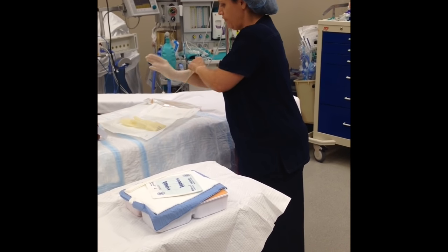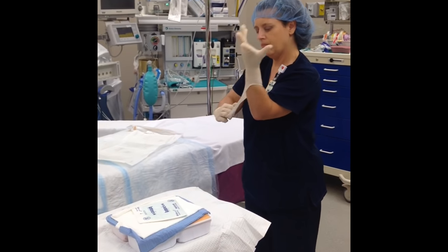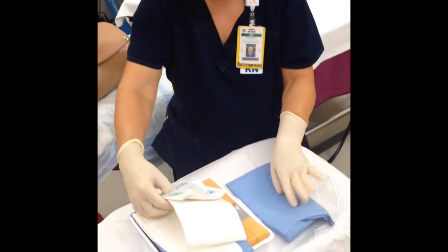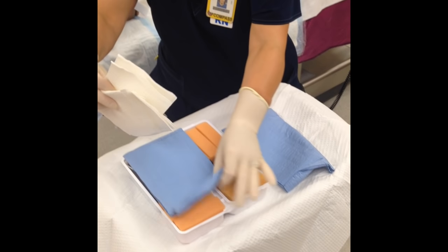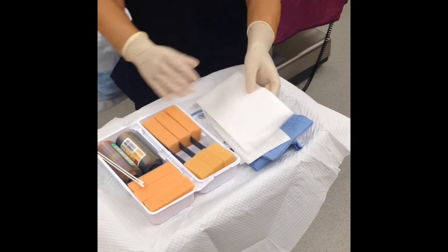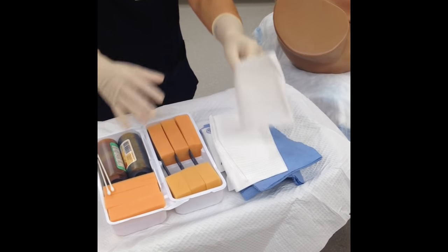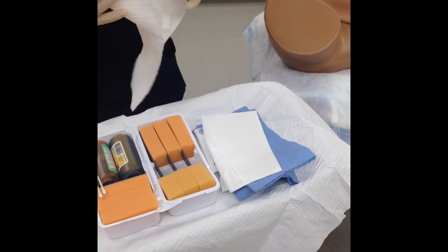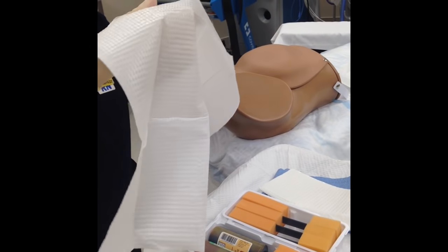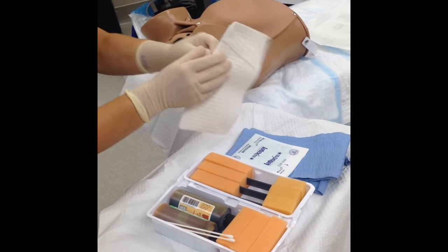Remember to perform hand hygiene before donning your gloves, which I have already done. I'm going to go ahead and arrange our kit. These white drapes will go underneath the patient to protect from getting any chemical burns underneath her buttocks. I'm going to protect my sterile gloves by cupping the drape and placing it underneath as so. You can use both if you want.